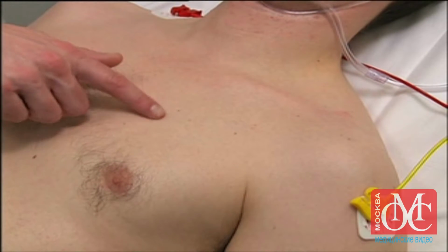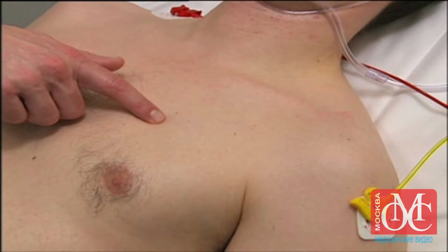The intersection of the midclavicular line and the second intercostal space is the correct place to insert the needle for aspiration of pneumothorax. It can be helpful to mark the needle insertion site with a skin marking pen.